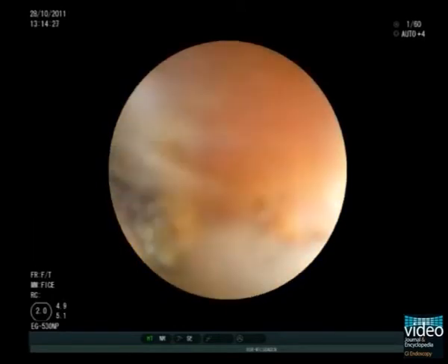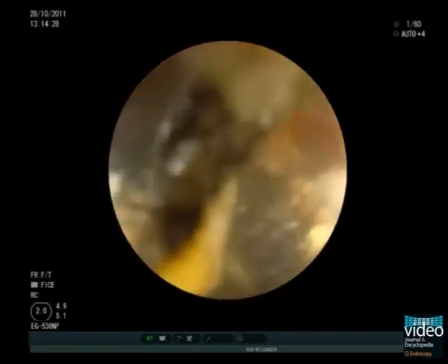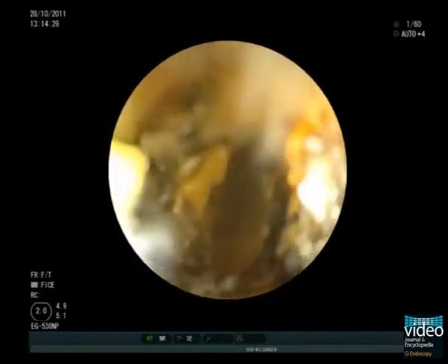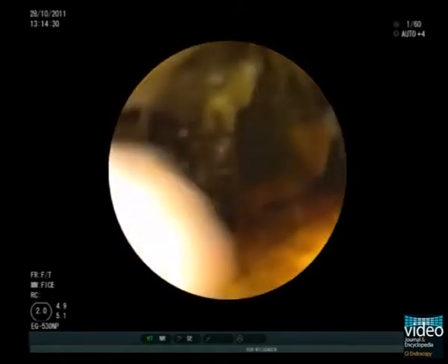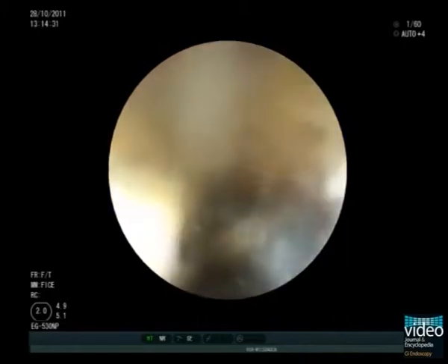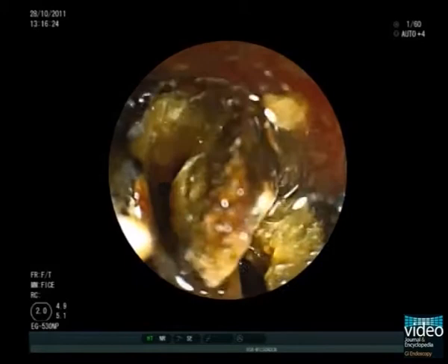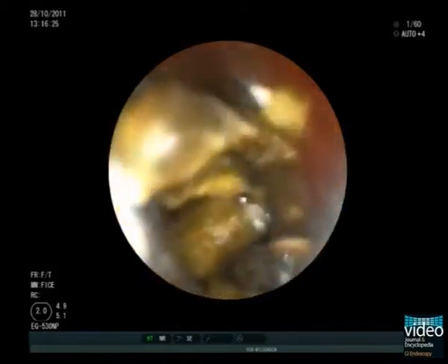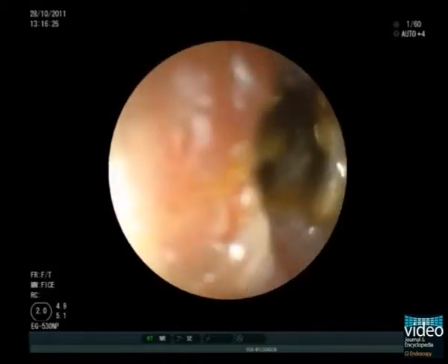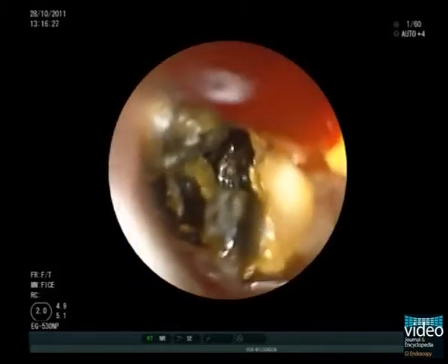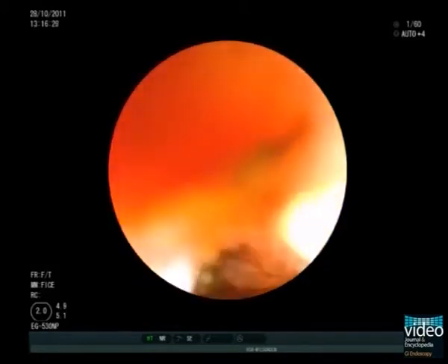Because stone fragments and sludge generated during lithotripsy may obscure the endoscopic view, irrigation through the channel of the endoscope helps to maintain a clear view of the stone. At this stage, the large stone is already crushed into dozens of pieces.